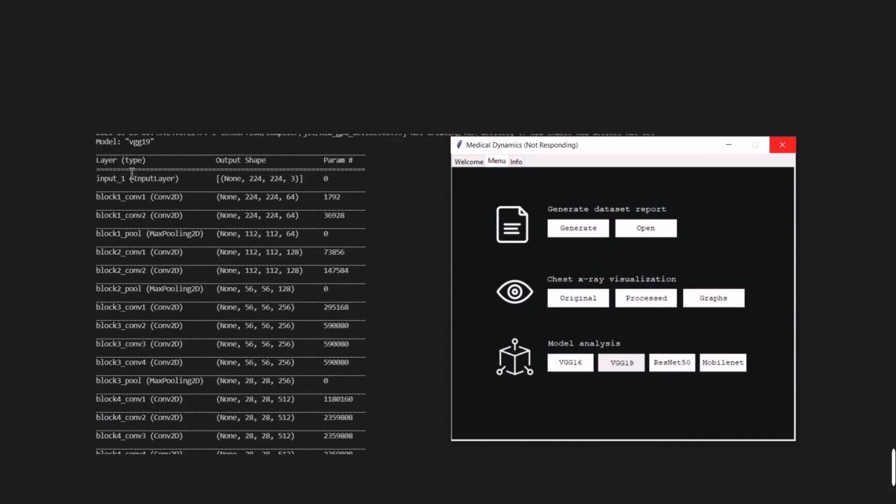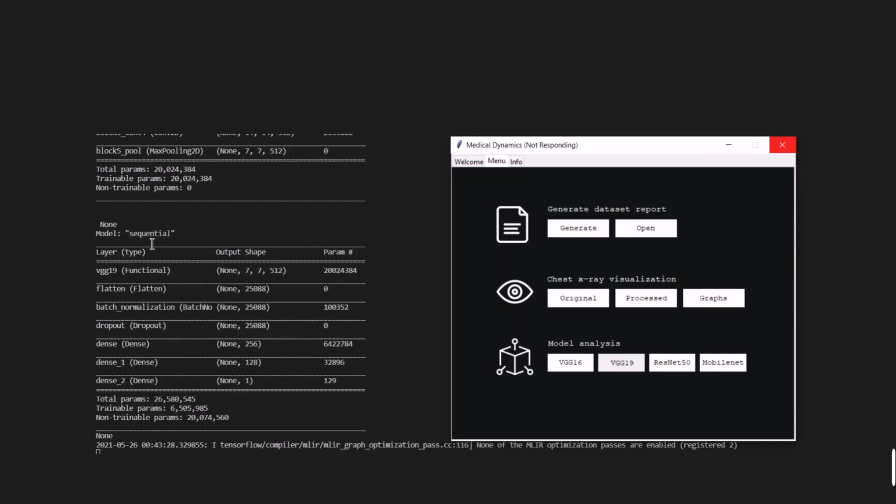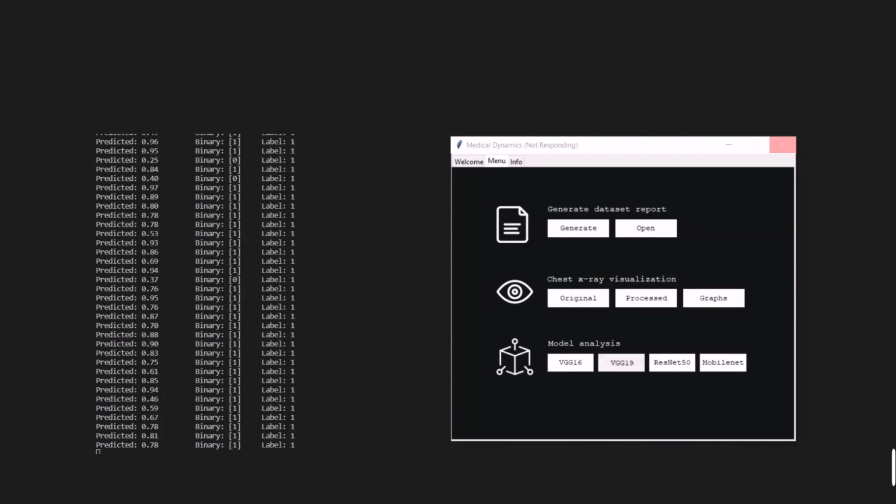Then after, the model will start making predictions given the H5 file which the model was previously trained on. Prediction times will vary from model to model. Models with deeper architectures will naturally take longer to make predictions than ones which don't. Once the model has made its predictions, its results are outputted.